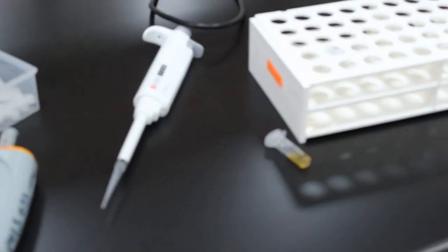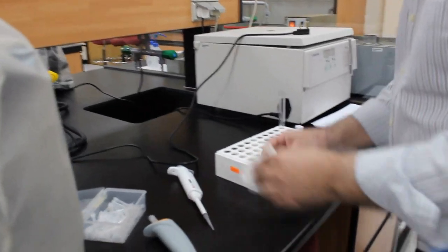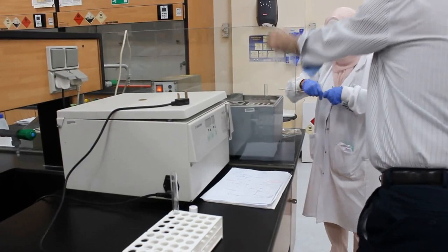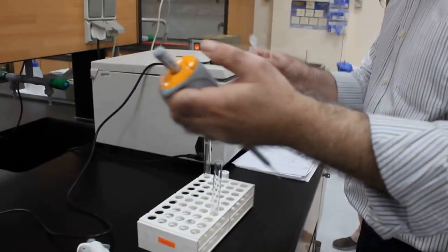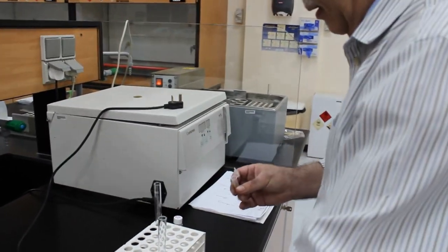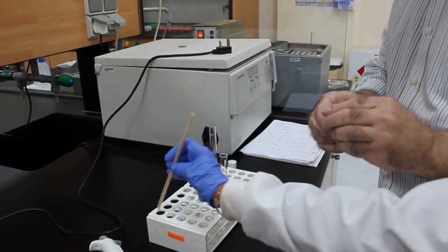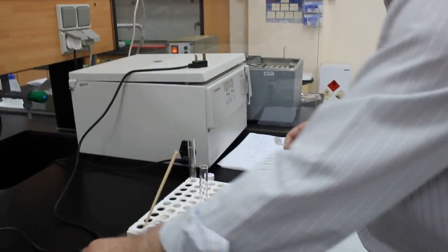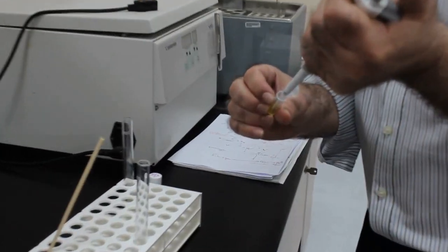Now, according to the manual, we have to take a tube that has been sitting at 37 degrees. We add 200 reagent first. 100 microliter of plasma.